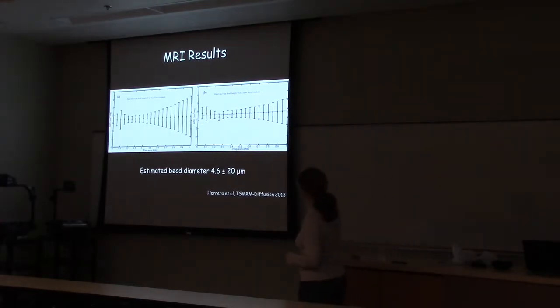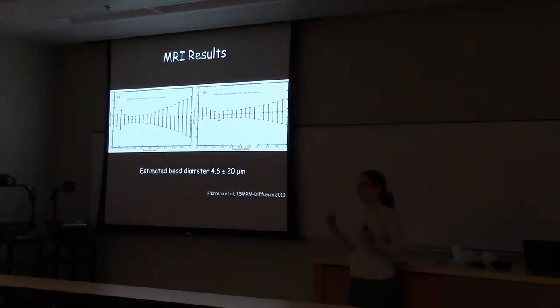So what's the difference between these two? Again, I mentioned that we have to do this as a function of frequency instead of time. To switch it to time, we need to take the Fourier transform of the gradient waveform and see what we get. With a sine wave, I'm sure you guys know this from engineering, you get a plus and a minus. With a cos, it's two pluses. So with a cos, we get the straight answer. With the sine, we get the plus and the minus. And with the delay, we actually get a 0 as well.